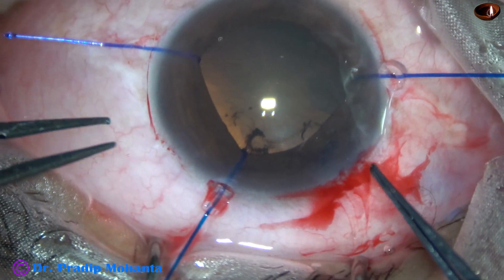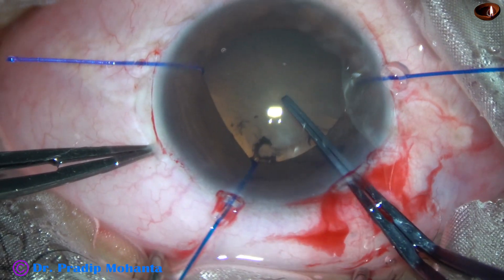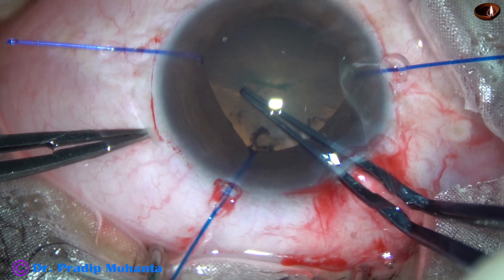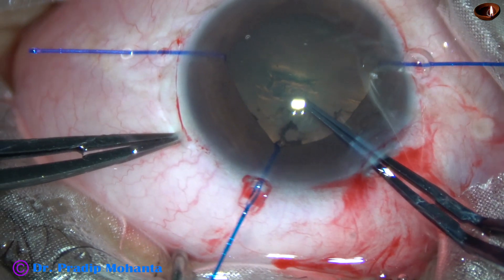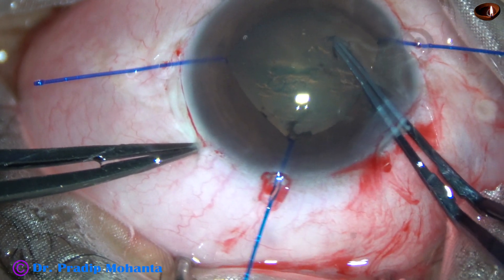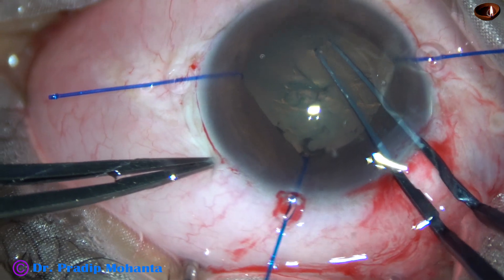Visco is filling up the anterior chamber and applied over the corneal epithelium for better visibility. See what happens as I try to do capsulorhexis — see the wrinkling and the whole lens tends to move. This means there is some zonular weakness, and probably many zonular fibres have been torn because of trauma.